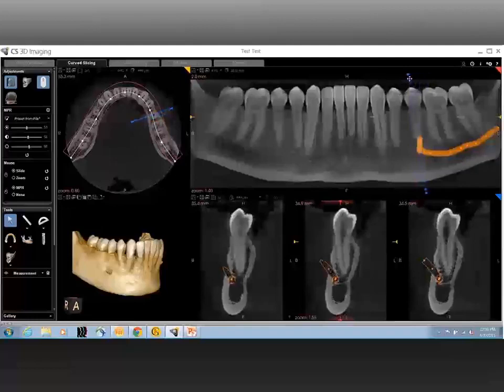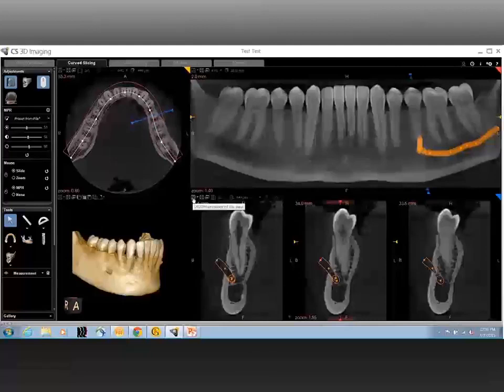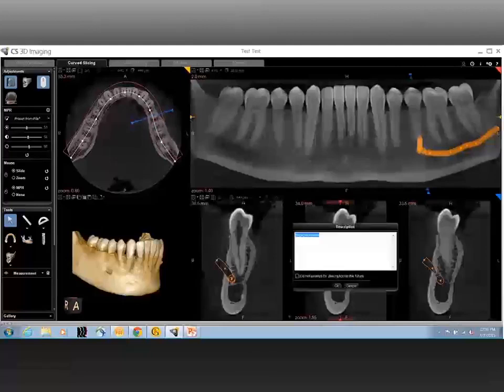Interesting. So going back to all these findings that you have mentioned, is it important to note these findings, and if so, why? Oh, that comes to essentially bookkeeping, and that's a very good question. It is important. Once you see a finding, it is important, just like anything else. It is important to note them in the patient chart because it shows that you have interpreted the scan, you have noted the findings, just like how you do it on a two-dimensional radiograph. And it's a process of bookkeeping and also for medical legal reasons.